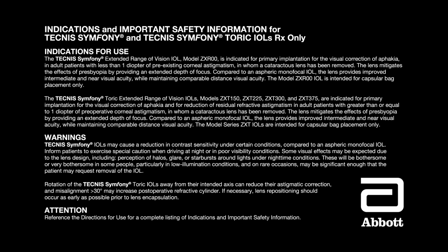Warnings. Technis Symfony IOLs may cause a reduction in contrast sensitivity under certain conditions compared to an aspheric monofocal IOL. Inform patients to exercise special caution when driving at night or in poor visibility conditions. Some visual effects may be expected due to the lens design, including perception of halos, glare, or starbursts around lights under nighttime conditions. These will be bothersome or very bothersome in some people, particularly in low illumination conditions, and on rare occasions may be significant enough that the patient may request removal of the IOL.